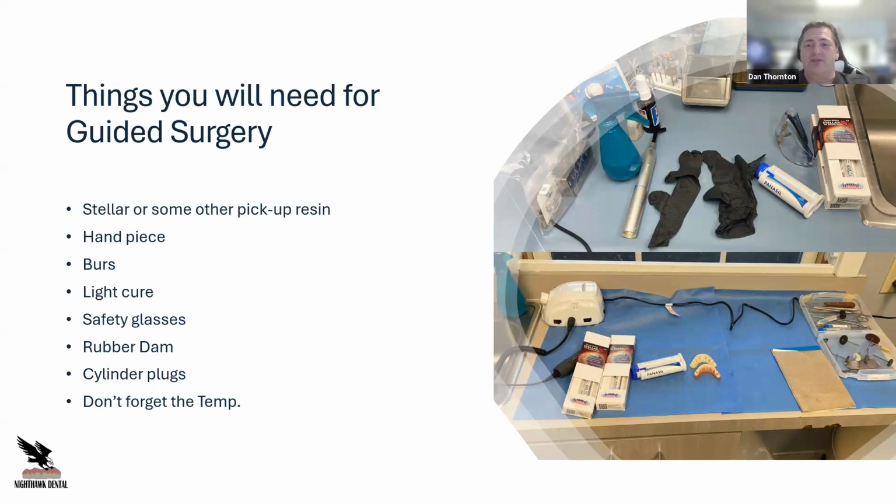Now, with the cylinders, I like to plug the holes when we're backfilling the holes, just to make sure that we don't get anything down inside of that cylinder hole and get that screw stuck. They actually make some nice little plastic plugs for these. Or one of the other tricks is just getting a cotton swab with a wooden stick with a little bit of Vaseline and breaking it off and putting it in the hole just to protect that area so you don't get anything inside, because it's a bear when you have to dig that out, or the doctor has to dig that out.